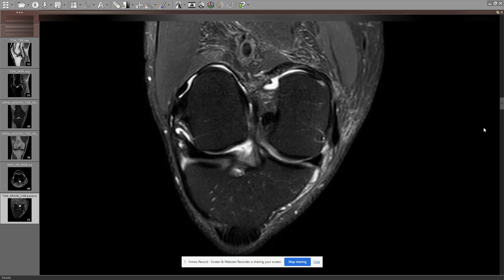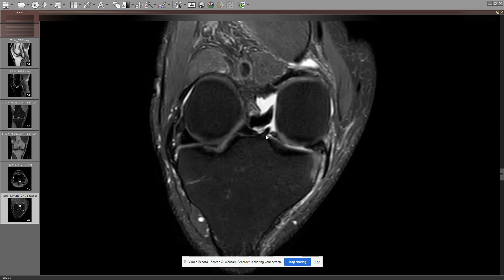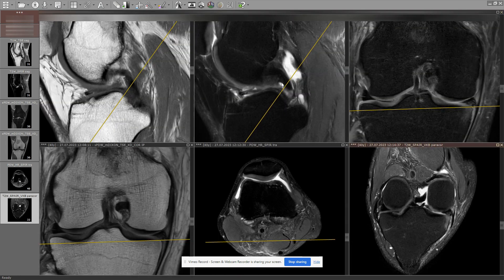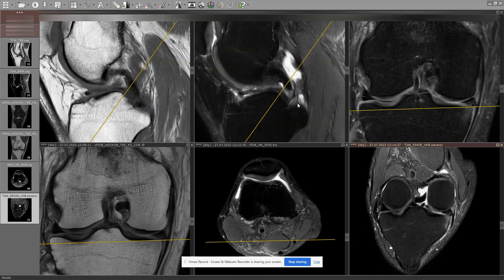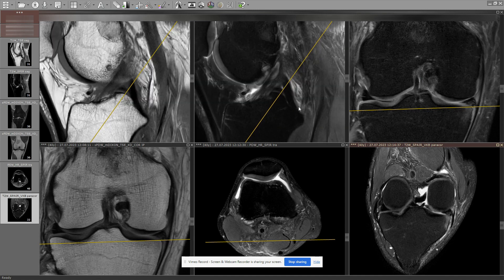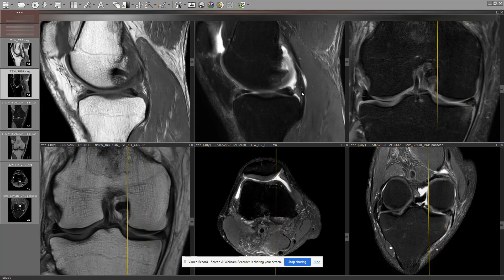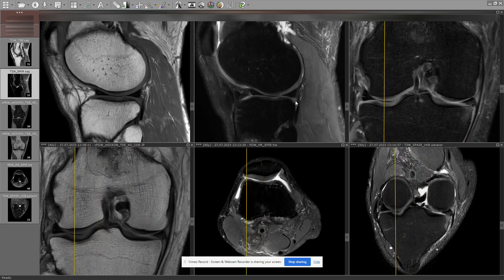It's more inserting into this bit here, so I think there's some form of a variant. It doesn't look injured. We also don't have any secondary changes for a pivot shift injury, so I would just go with a continuous, maybe just thin anteromedial bundle. No tear. And the PCL looks fine. Maybe there's a tiny ganglion cyst here, but everybody has this — I think it's more like a joint recess — so we didn't miss anything there.